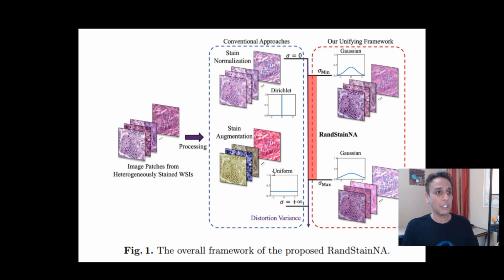So they're combining these two to make sure that you define a space within which you can actually do this augmentation and the normalization. Your output images, just like I showed you in the previous screen, have all these variations in look and feel, but those are real variations that your future images may look like, depending on sample prep, or depending on tissue thickness, and many other factors, as you probably know.